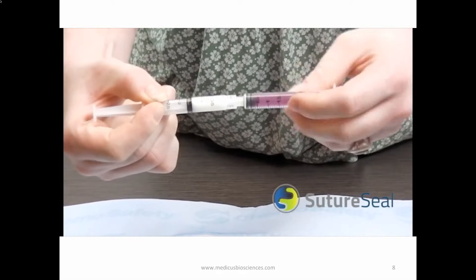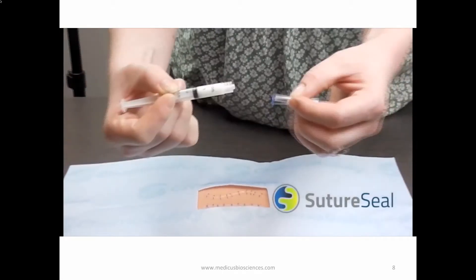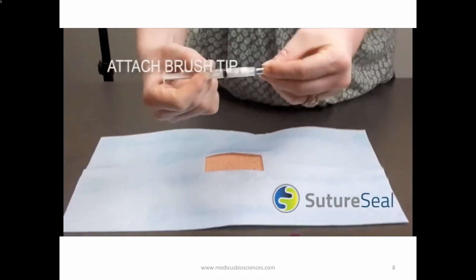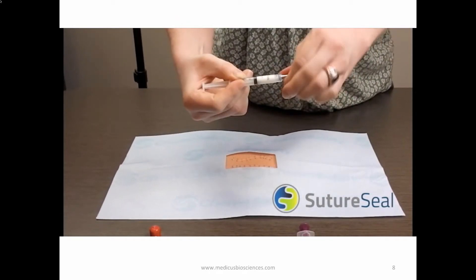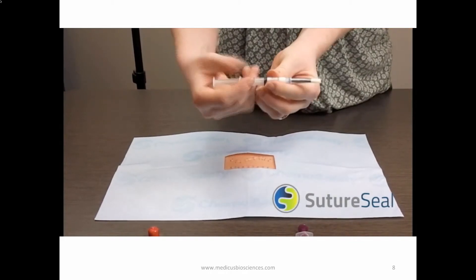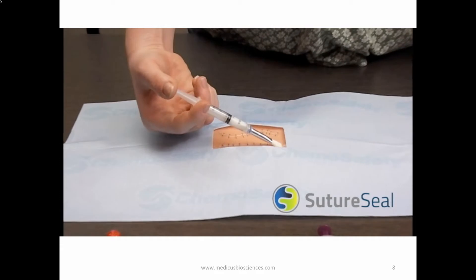Once mixed, push all the liquid into the larger male syringe. Disconnect the two syringes and then attach the sterile application brush tip. After the products are mixed, you have approximately one minute to apply the SutureSeal polymer to the sutures or wound area.